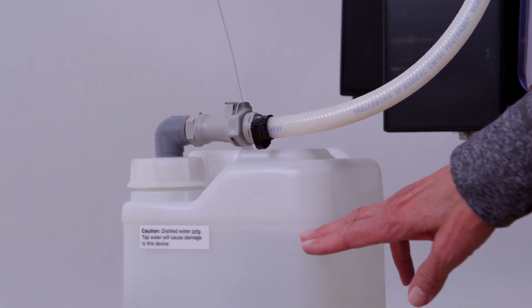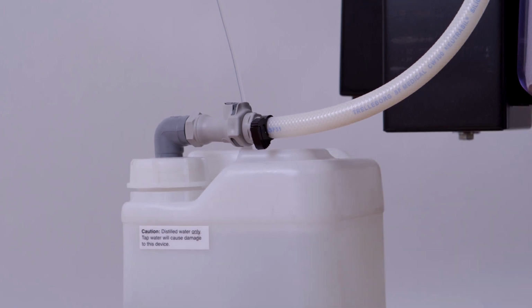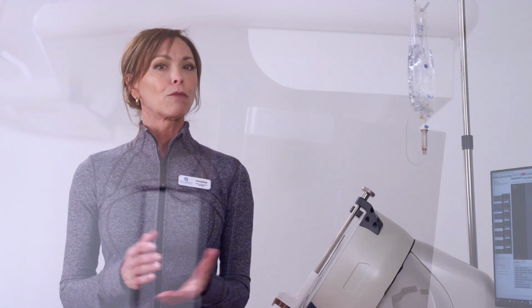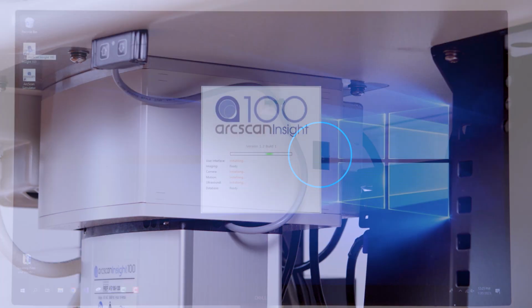At the start of the day, there's a short checklist to make sure the Insight 100 is prepared. First, check there's enough BSS for the first few patients. Then, check that the distilled water is at the correct level, usually at this top indentation, unless you've been instructed differently. Power on the computer and check for Microsoft updates. If prompted, perform those updates and restart the computer. Power on the device and launch the software.